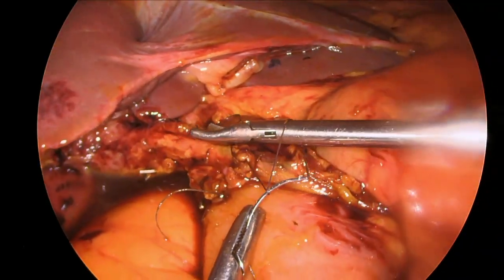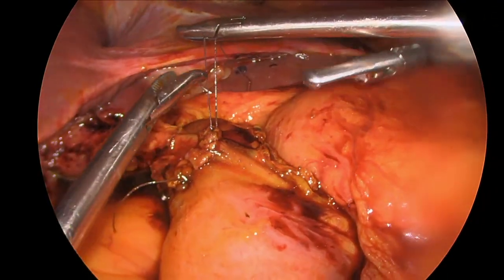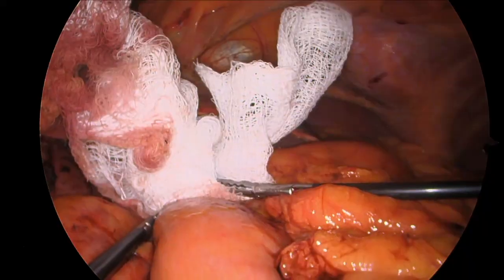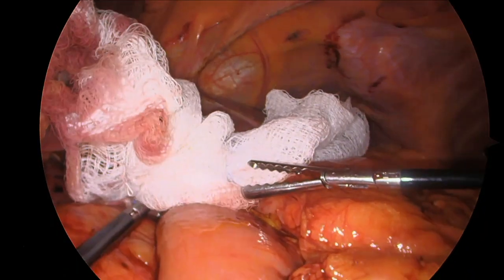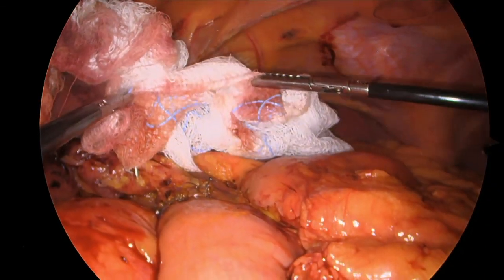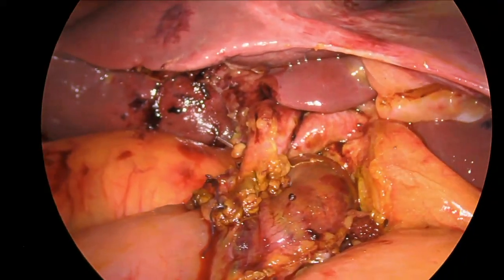The suture is tied down and the anastomosis is completed. A clean white sponge test is done to ensure that there's no bile leak, and we can see that the sponge continues to be clean and white with no yellow, indicating no bile leak. Here's the anastomosis — it looks wide open, patent and sound.